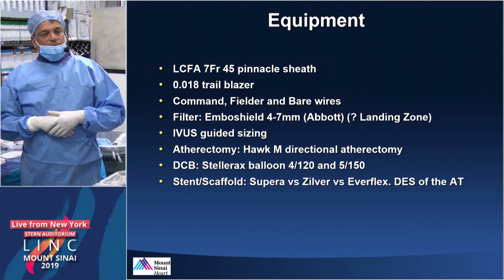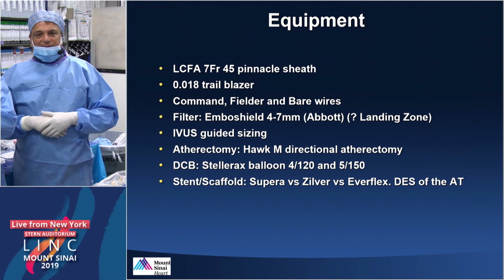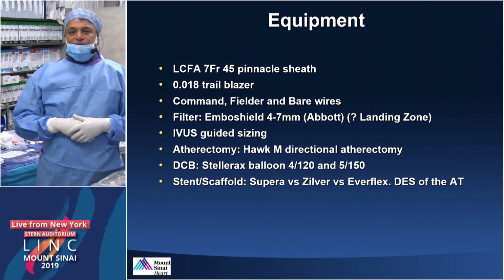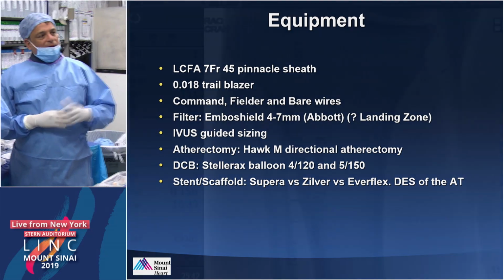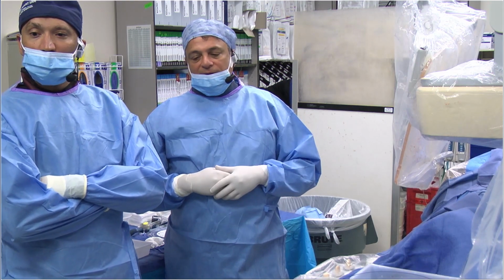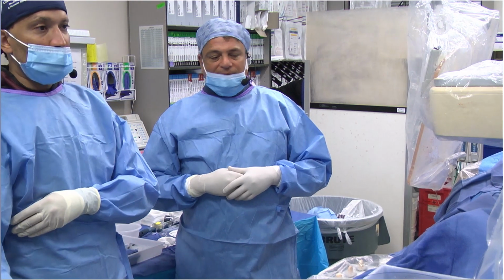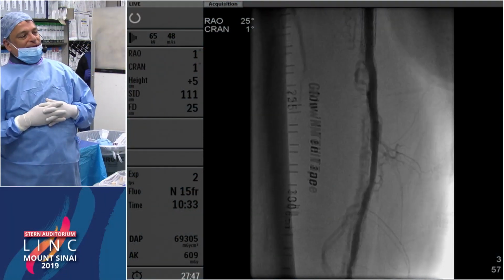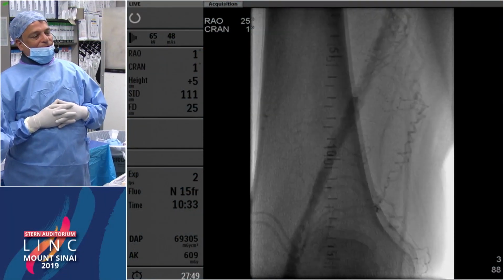So what we did was we brought him back and did an angiogram and set him up because I think he has some unique problems that are decision-making issues. Technically, there are some technical issues as well, but clearly there are decision-making issues in this case. So I'm going to have Dr. Guja play the case.